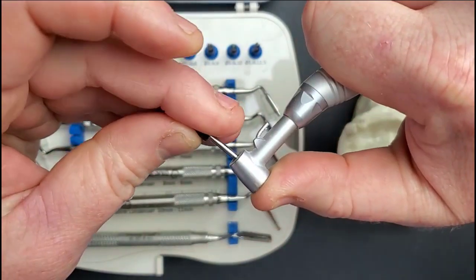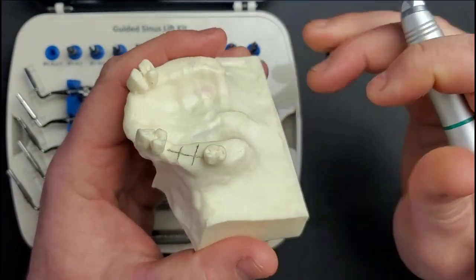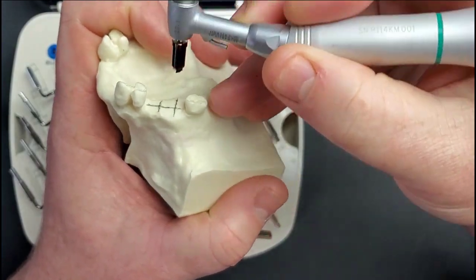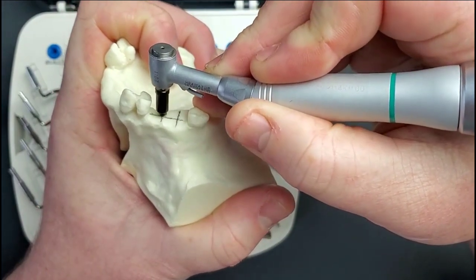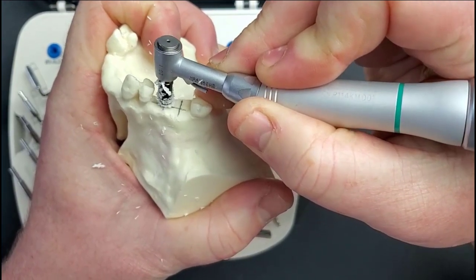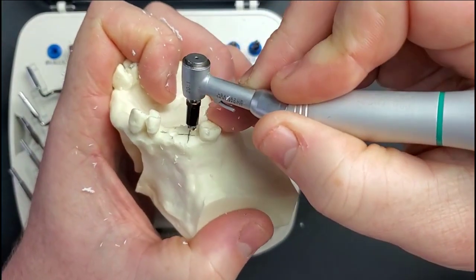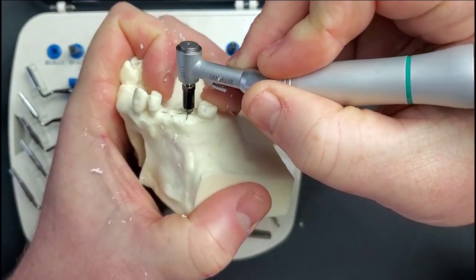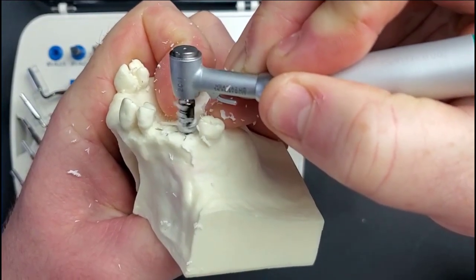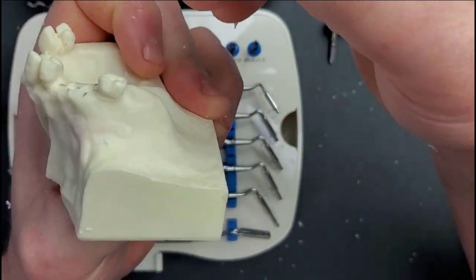Always start with this drill. We'll place this into the handpiece — I've given myself some marks on the model to indicate where I want to do these implants. We'll place two implants on this mock model with the handpiece set at about a thousand RPMs, and I'm just going to go right where I want to start my osteotomy. This is only two and a half millimeters deep, so we know we're well short of the sinus distance. I drill down until the built-in key actually bottoms out on the bone.